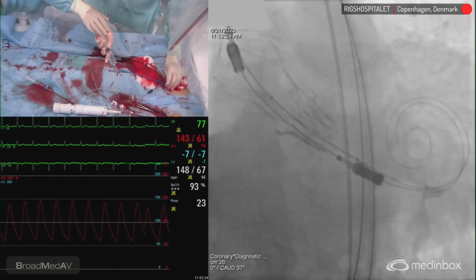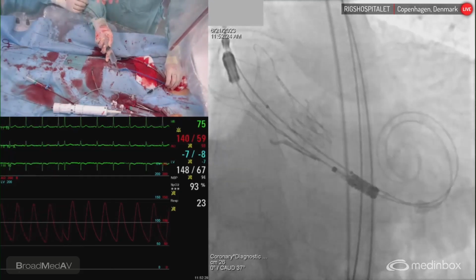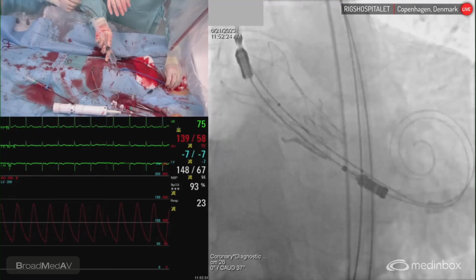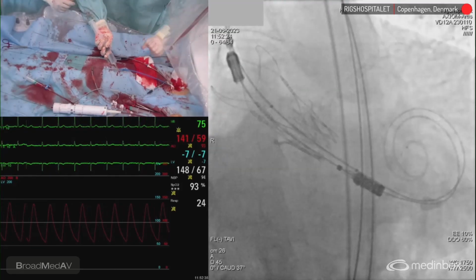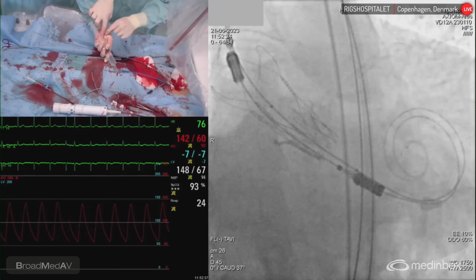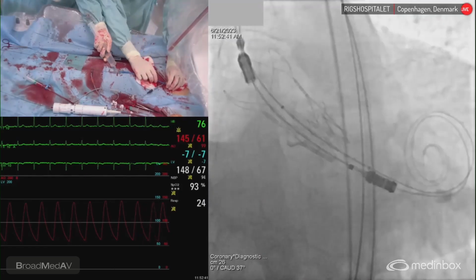So we only go up with the balloon if the pressure is down. All right, and it's a very quick inflation and deflation. Not necessarily even all the way. We just want it to expand, just a matter of quick up, and for sure in this scenario don't pull the thing out. Okay, good.